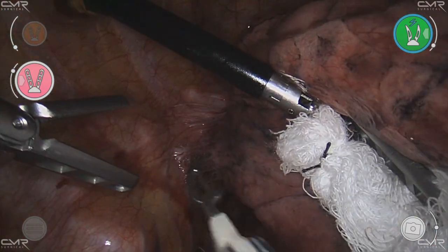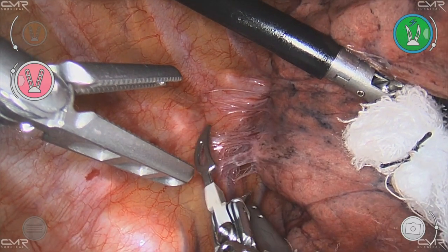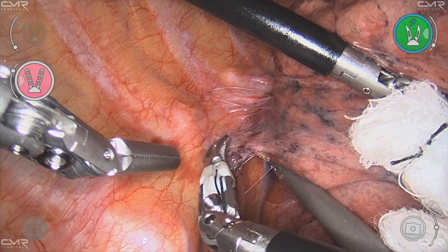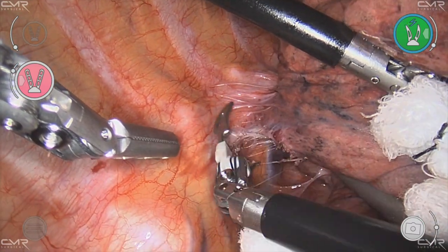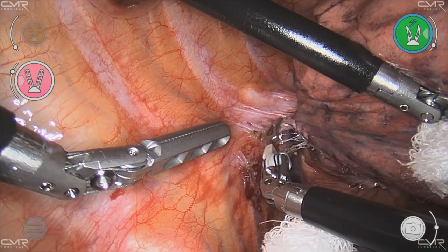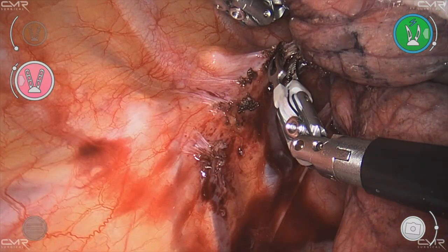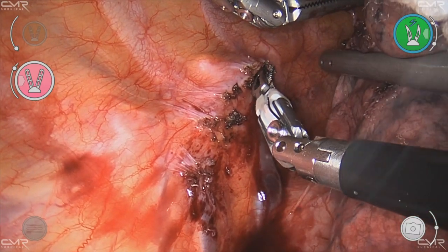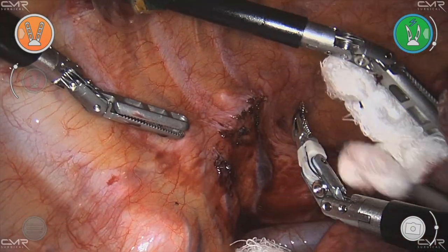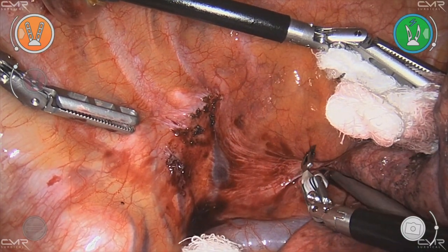We've got CO2 in the chest at a pressure of six millimeters of mercury, flowing at six liters per minute. This was a posterior tumor up to the parietal pleura — right where the tumor was just touching the chest wall. We started by taking down some light adhesions, identifying where the tumor was. The angulations of the Maryland are very nice. We always put two cigars in the chest for safety and padding. You need a valve CO2 sucker because otherwise you'll suck the CO2 out and the lung will come up — this is a five millimeter valve sucker and it works very nicely.